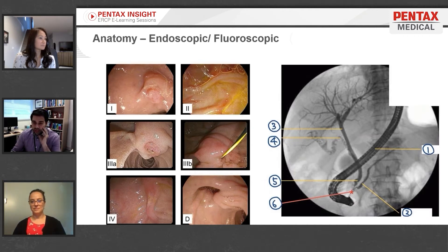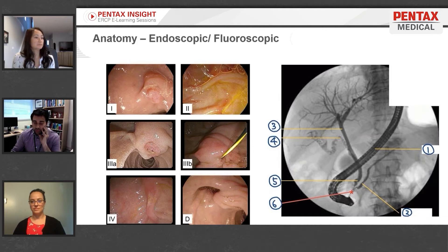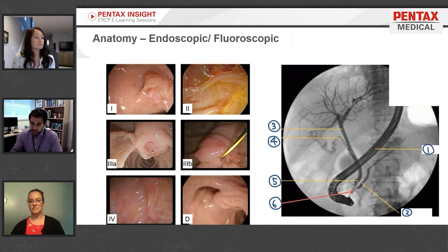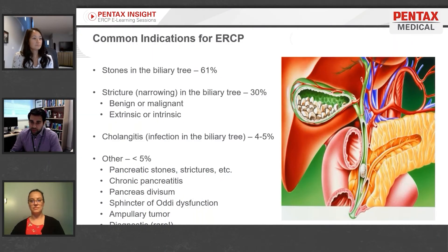The panel on the right shows real-time fluoroscopic imaging — essentially a moving X-ray used during ERCP. You can identify the ERCP scope as structure one. Two and five are the two ducts: two going right is the pancreatic duct, five is the common bile duct going up toward 11 o'clock. The cystic duct with a gallbladder full of stones is at number four. Above the cystic duct insertion — number three — is the common hepatic duct, with the right and left ducts above that.